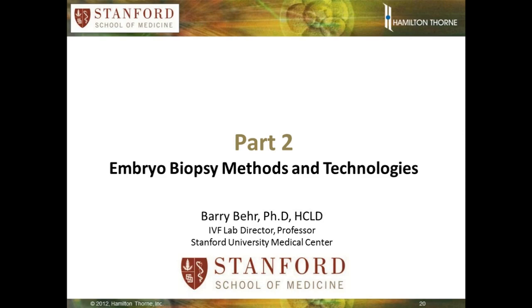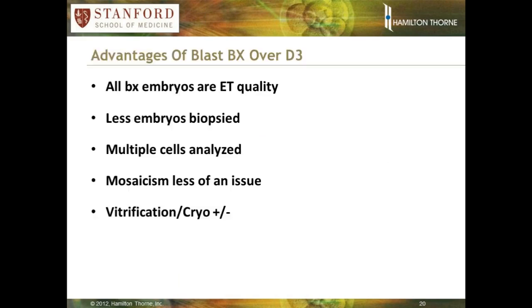It's my pleasure to talk to you today on embryo biopsy methods and technologies. I'm going to focus these next 15-20 minutes or so particularly on laser and biopsy technologies for pre-implantation genetic diagnosis or pre-implantation genetic screening, more than assisted hatching, which has been around, as most of you are aware, for 20+ years. First being applied with partial zonal dissection and acid tyrodes, and more recently, I think, by most people using lasers.